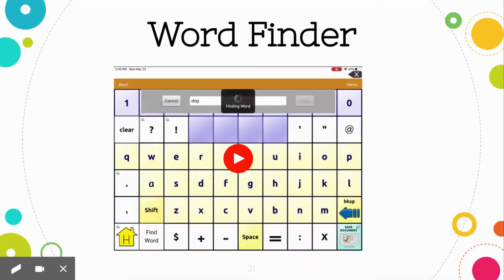So as you saw in the video, there might be multiple ways to say the same word to navigate to the word you want to say. The first one is usually the quickest, so sometimes it helps to look through the list and make sure you're getting the quickest option.